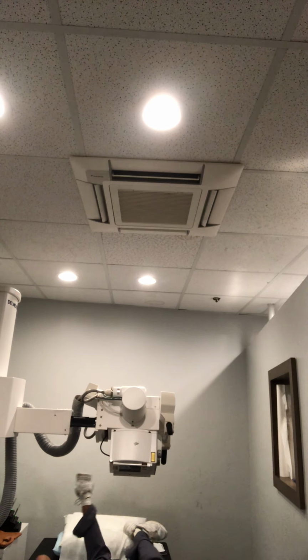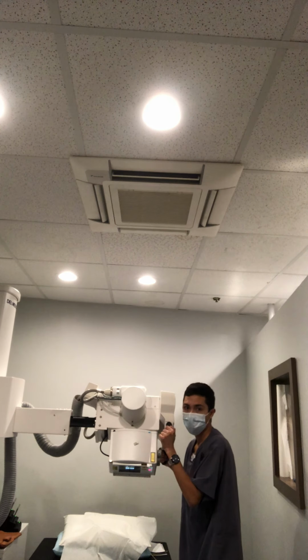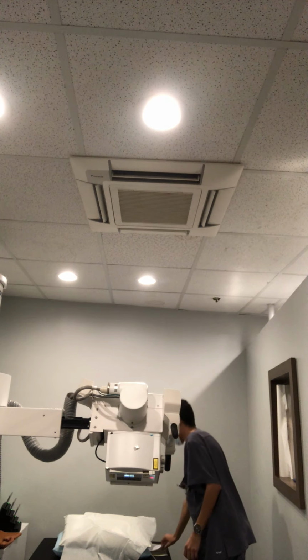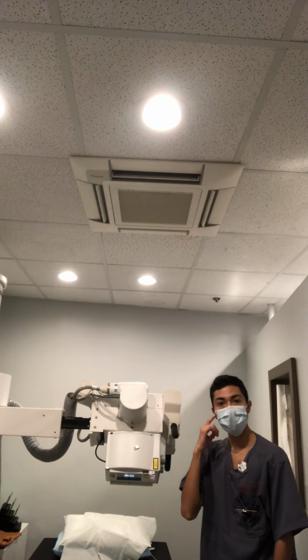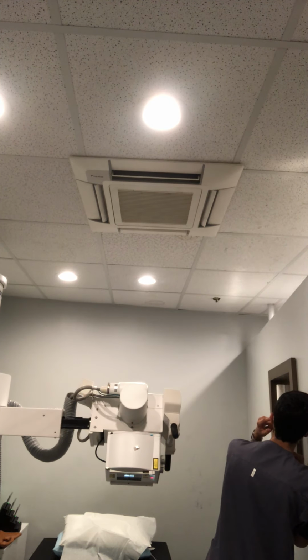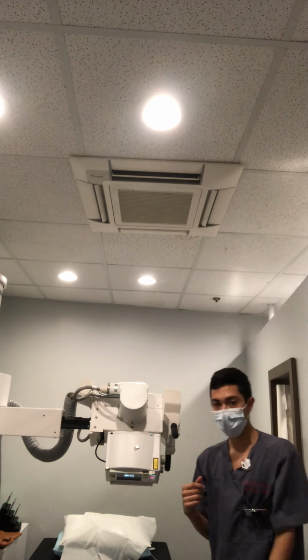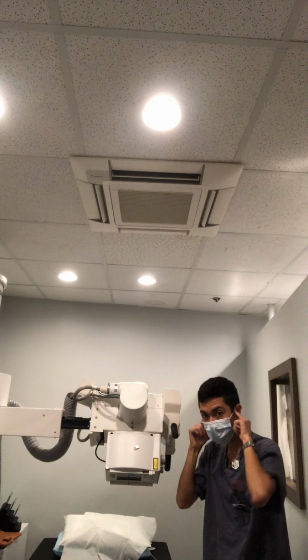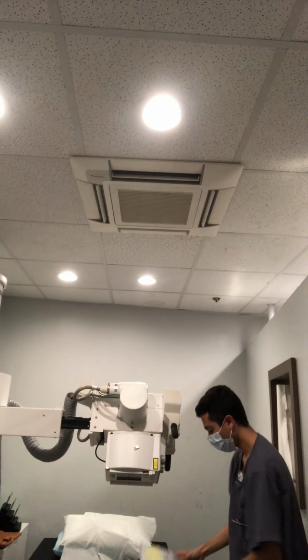they're obliqued, and then you'll have your central ray already angled 25 to 30 degrees caudad, and once it's set up, you could move the table and stuff like that. And make sure, I'll tell you guys how to center. Okay, so central ray, where does it enter? So you start from the EAM, right? So they're like this for the upside, right? So you would go 1/2 inch anterior and 2 inches superior, because if you feel your EAM and then you go up just a little bit, you'll feel like the little hole, and that's where you gotta center. It's like right there.